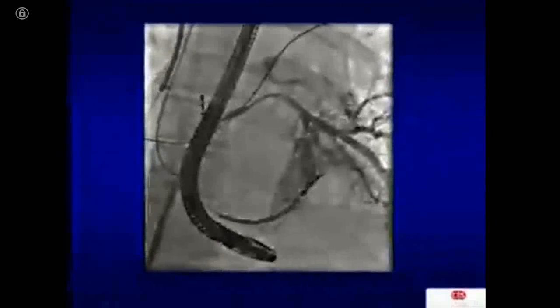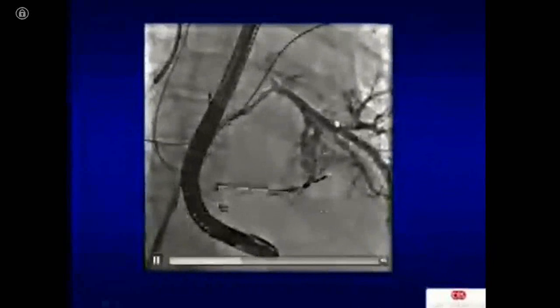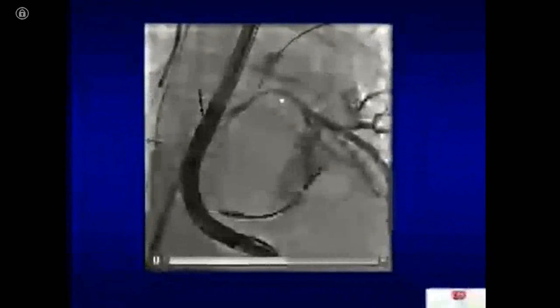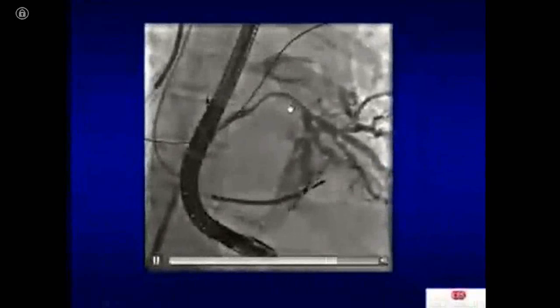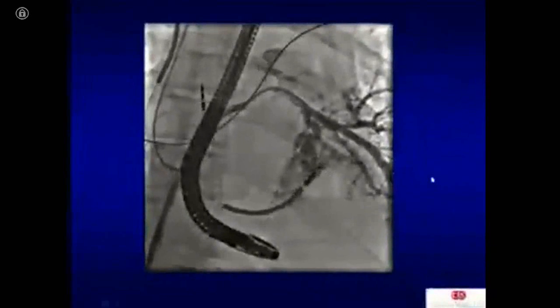But the reason is that obviously this was at the ostium where it enters into the pericardial sac, and you can see that there's a clear tear and there's blood just gushing out, and you can see this blush. This is actually all the collateral from the previous vein. So this is now 1 liter of blood.